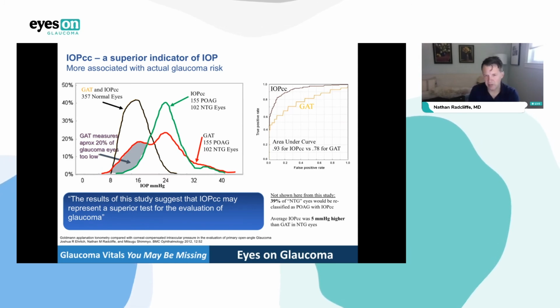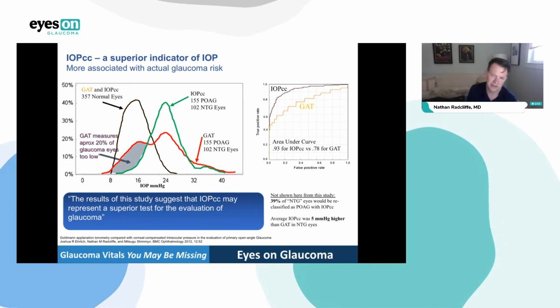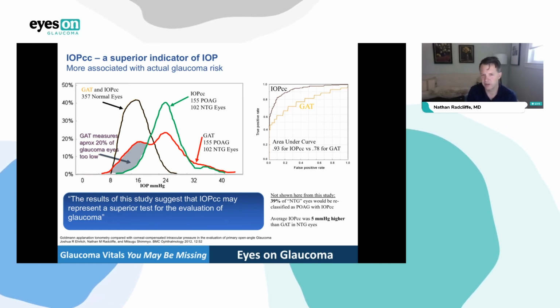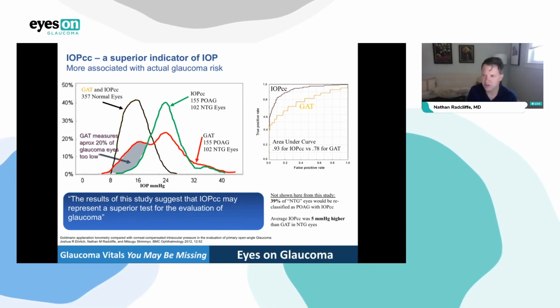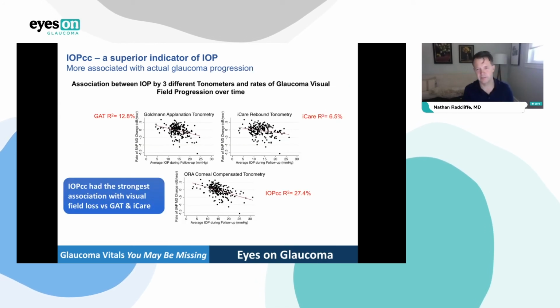And I find it to be, in my research at Cornell, where I compared my Goldman measures and my IOPcc, I felt like I had more confidence in my IOPcc from Ora because, think about it, who's going to do a better job of checking a patient's pressure? A machine or a technician who's stressed out, is frustrated because the patient's blinking, moving their head, squeezing, too much fluorescein in the eye, your patient's not looking in the right direction, all those things that mess with Goldman just can't affect the air jet. So I like that system very much.